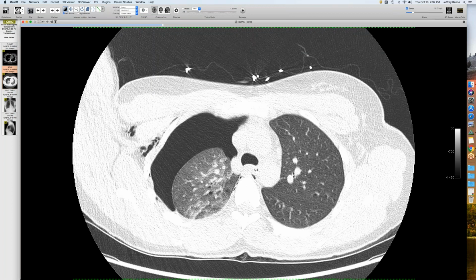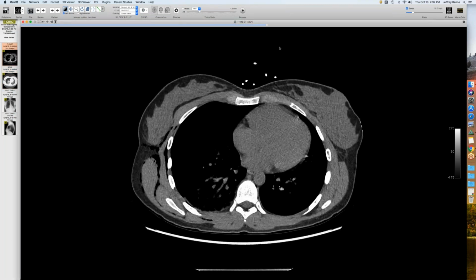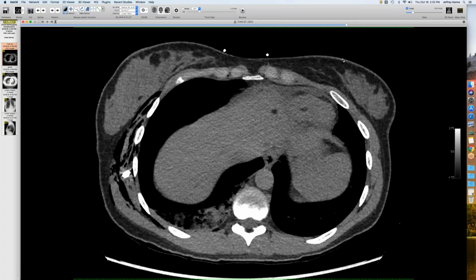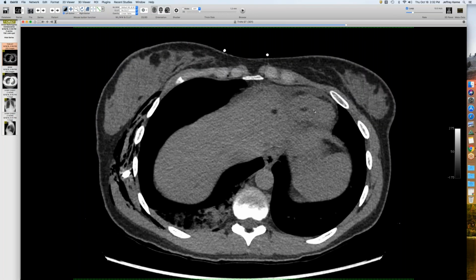So Jeff, are the heart tumors also angiomyolipomas? I don't know the answer to that. Maybe Travis knows. Howard? I don't know. It's hard to get a good answer on that histologically. We always just call them intramyocardial fatty foci. I've never had one that was actually biopsied personally, but I don't know. I'll have to look and see. Unless Howard knows. No, I don't. I always just describe them as such as well, when on occasion we see it.